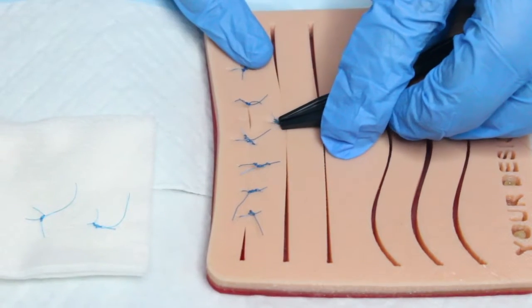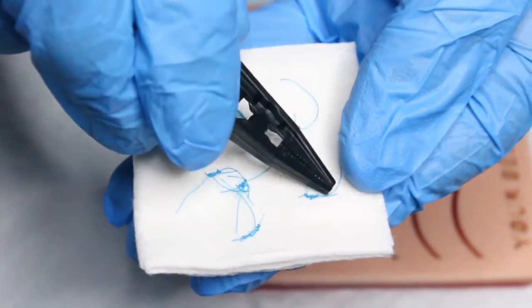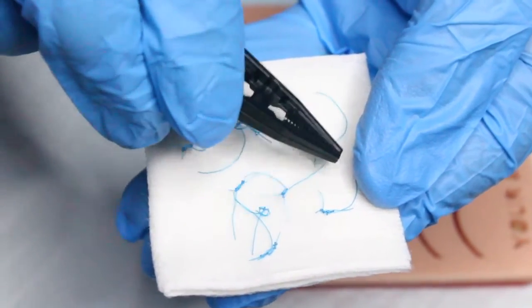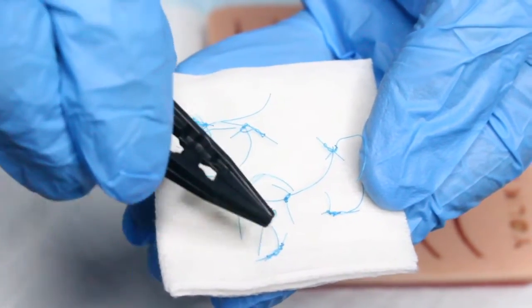Be sure to educate the patient on proper cleaning and hygiene. Once all the sutures have been removed, count how many were placed on the gauze square and verify the correct number have been removed. Then clean up your work area, discard any supplies, and ask the patient if they have any questions.